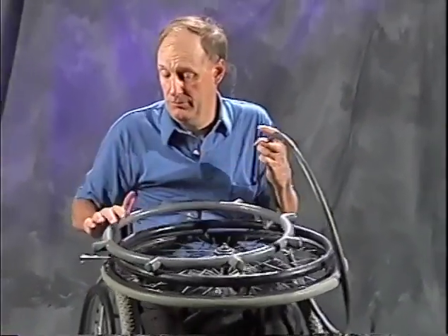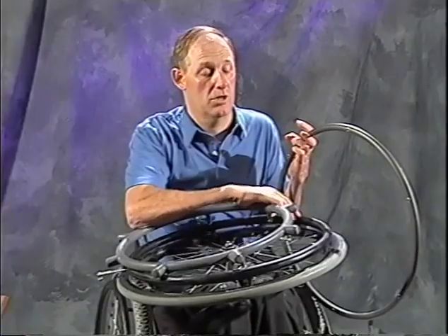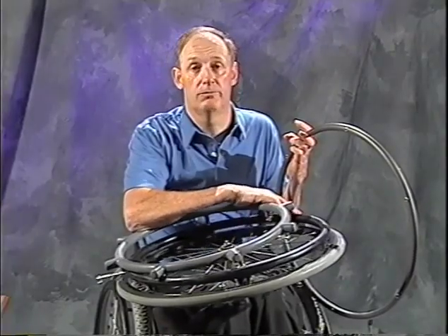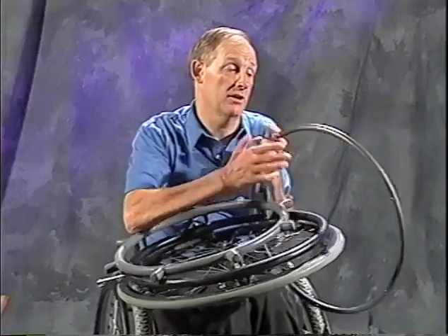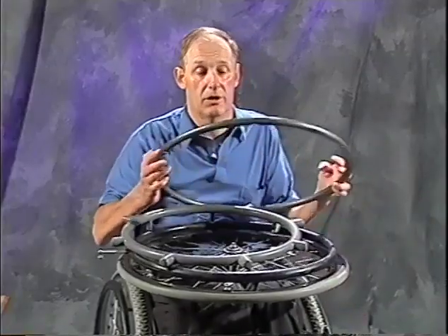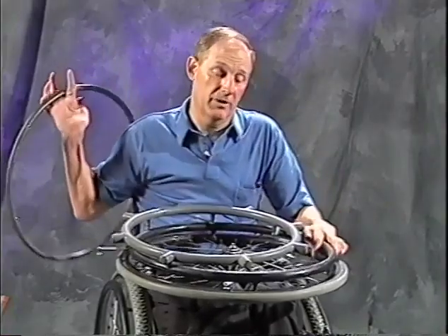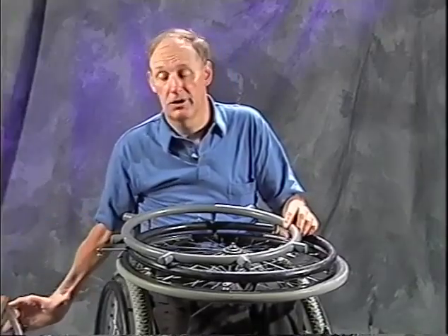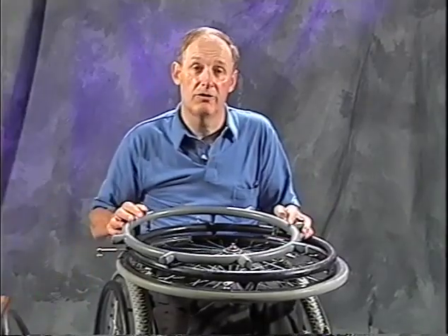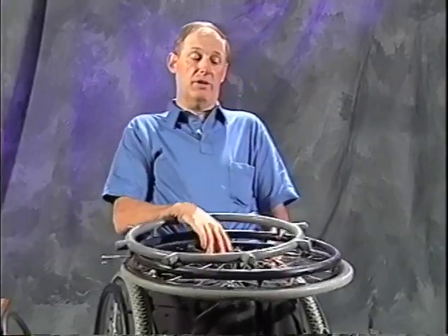Basically, higher quadriplegic, quadriplegic with some lower functioning like a C6, C7 area, and paraplegic. Basic rule of thumb: nice and light, a little bit heavier, a little bit more awkward, but easier to push without having to strain yourself to get a grip. So all three of these hand rims have their places.